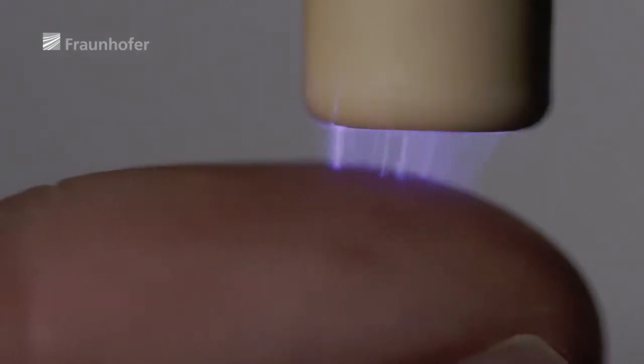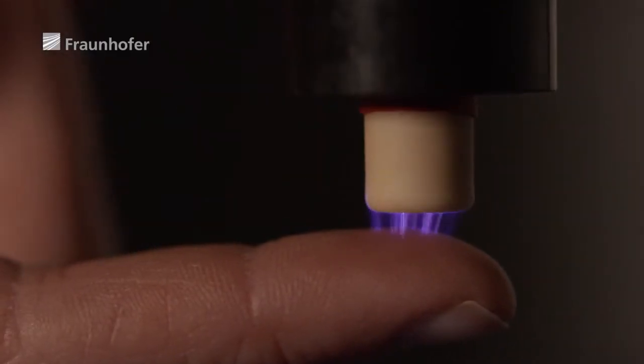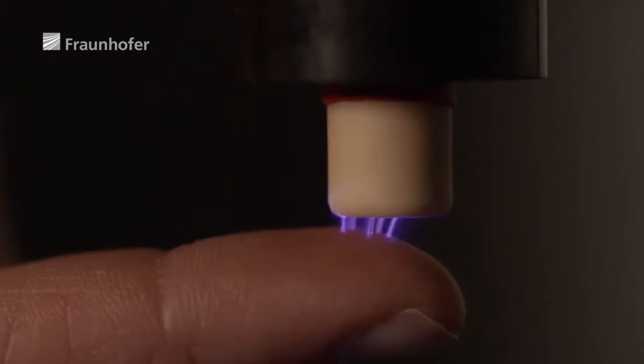So what we do is to generate very small, tame, low-temperature lightning bolts on the skin in order to heal it.